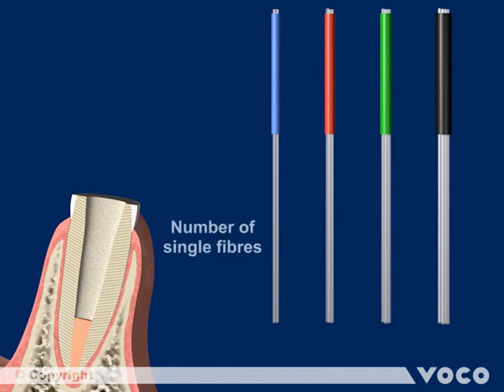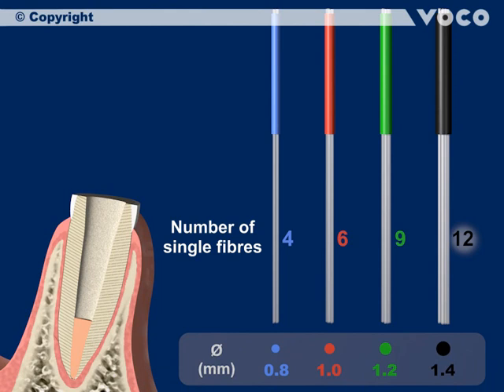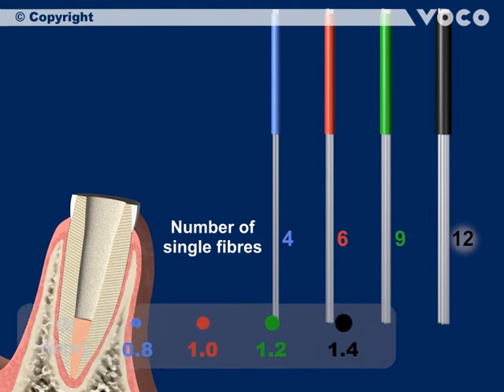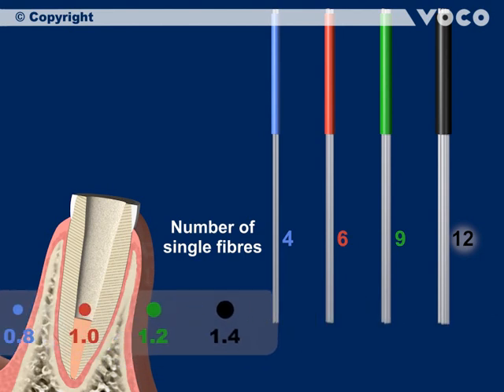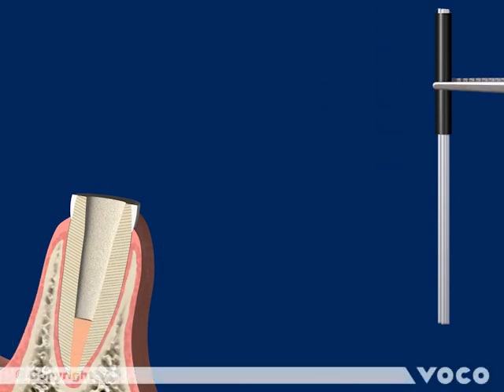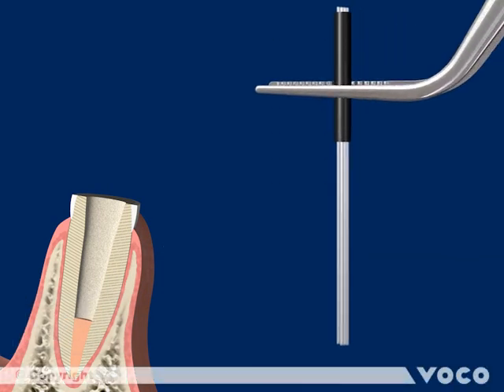The approximate diameters of the Rebilda Post GT are: 0.8 mm with 4 single posts and a blue sleeve; 1.0 mm with 6 single posts and a red sleeve; 1.2 mm with 9 single posts and a green sleeve; 1.4 mm with 12 single posts and a black sleeve. Disinfect the selected post with alcohol.